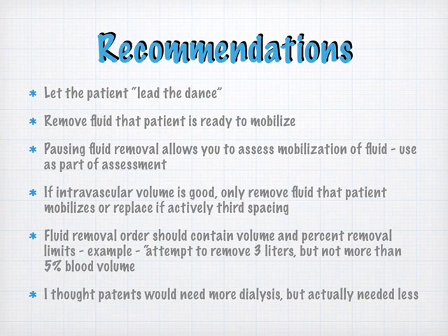And I thought that patients were going to need more dialysis, thinking this way, and by just taking off fluid when they wanted to give it, because I felt like in the beginning of their disease process of sepsis or surgery or whatever it was, that if we didn't get at some of that fluid, then we're going to pay for it later. And we're going to have to do extra ultrafiltration or something like that. And that's not what I actually found.